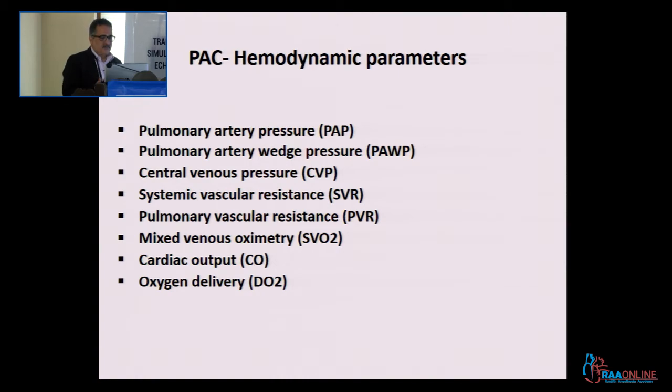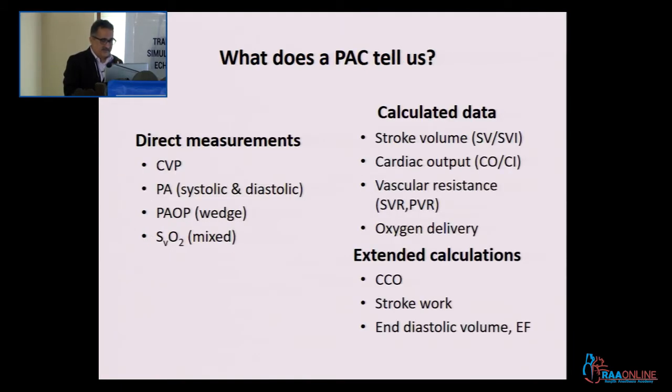Right ventricular pressure, we can obtain the pulmonary artery pressure and the pulmonary capillary wedge pressure, or PCWP. Then we can also calculate the hemodynamic variables by obtaining these values, like systemic vascular resistance and pulmonary vascular resistance. With special catheters, we can obtain the mixed venous saturation and the cardiac output, as well as do the oxygen dynamics with the pulmonary artery catheter. We can have the data from the pulmonary artery to have the oxygen dynamics.